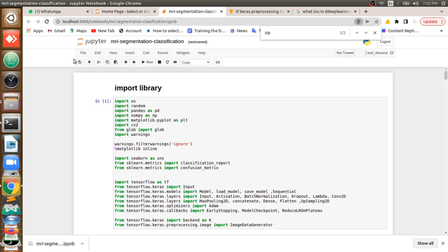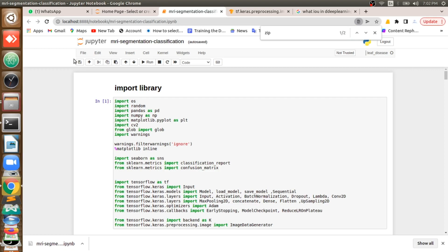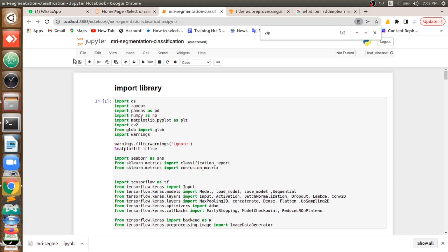So this is the problem statement. In our case, we have a dataset that contains tumor and non-tumor images. For tumor images we have a mask of that image, and for non-tumor images we have a black image — meaning there is no mask at all, because there is no tumor region.